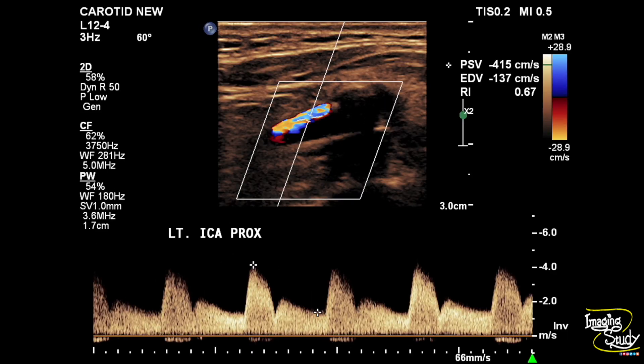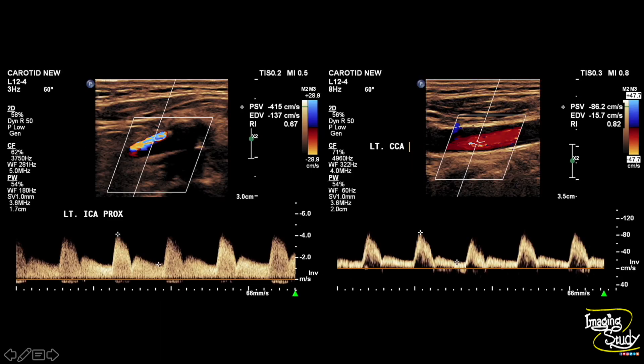Here is the measurement and you can see the peak systolic velocity is 415 centimeters per second, which is quite high in comparison to the common carotid artery.